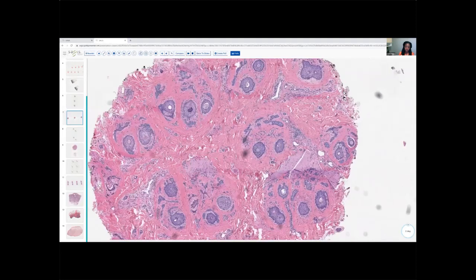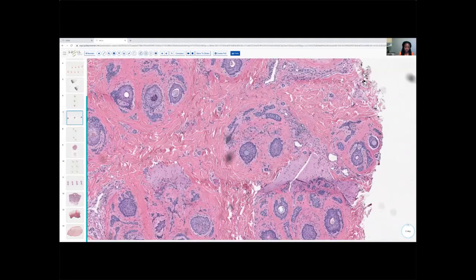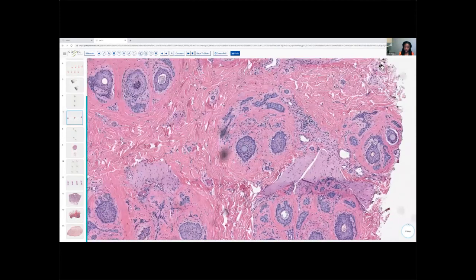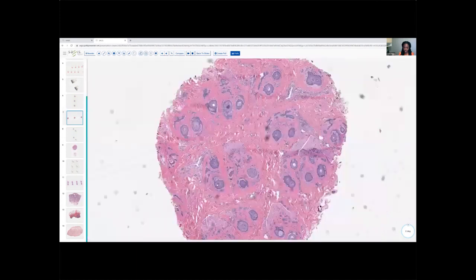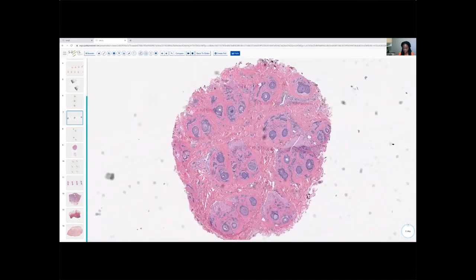And it looks like it's mostly lymphohistiocytic. And then we also see that there's a striking catagen telogen shift. So certainly in this example, more than 15%, 15 to 20% of our follicles are in the catagen telogen phase. Okay.